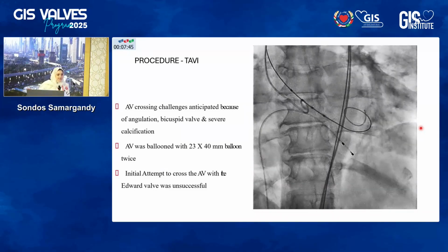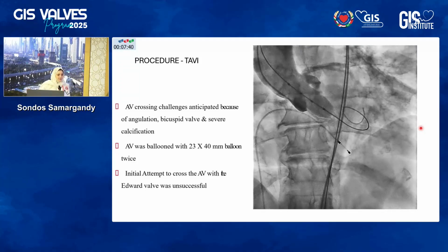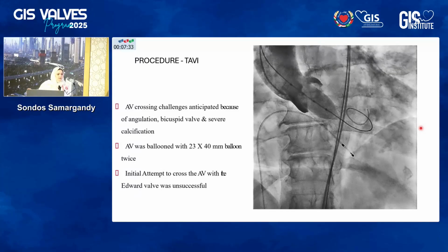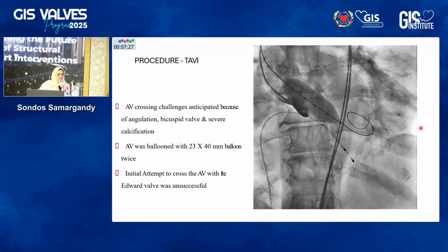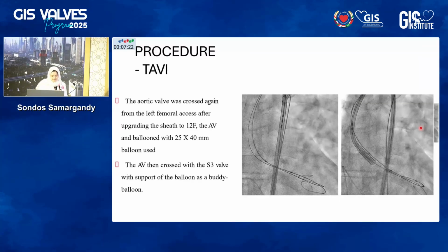Yeah, I think the good dilatation first, then using a good support wire, whether the Safari or pre-shaped wires, or going back up to the stiffer wires like the Meier or Lunderquist. So it's the wires, one of the possibilities. The other thing is to use the anchoring method, either to take a second wire as a buddy wire, or to support it with a balloon.